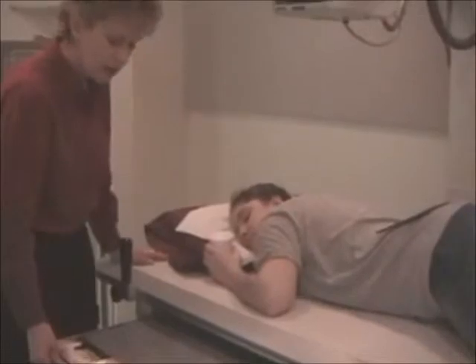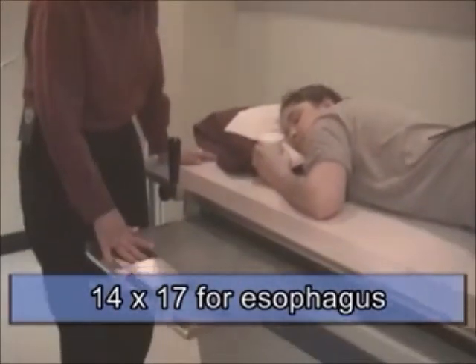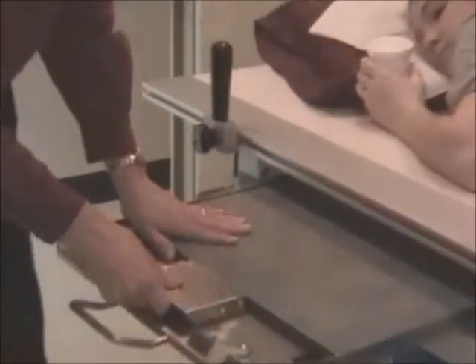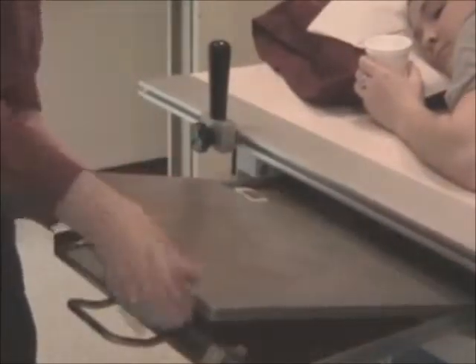For an esophagus, we generally use a 14 by 17 film. I have the ID to the top, and the right marker is moved in a ways because I will be showing collimation on the two sides.